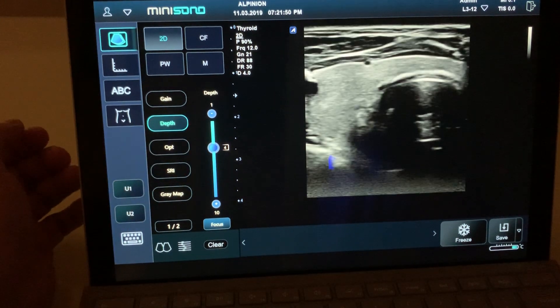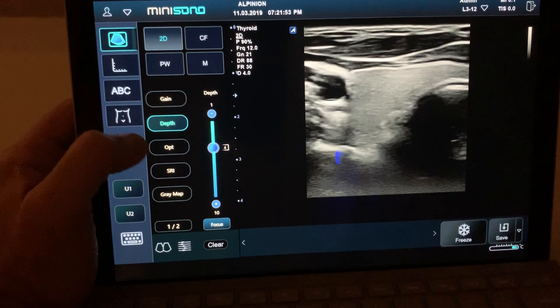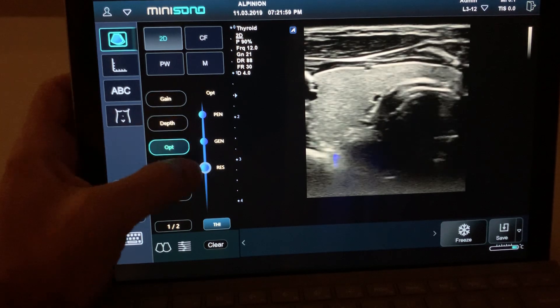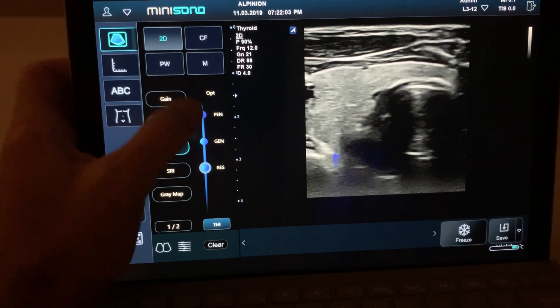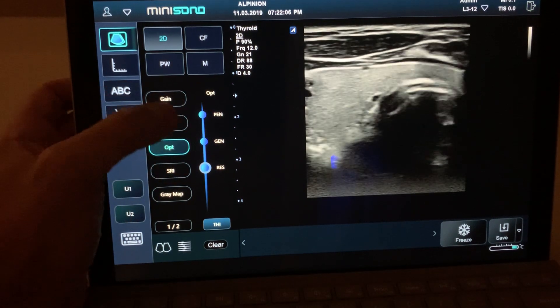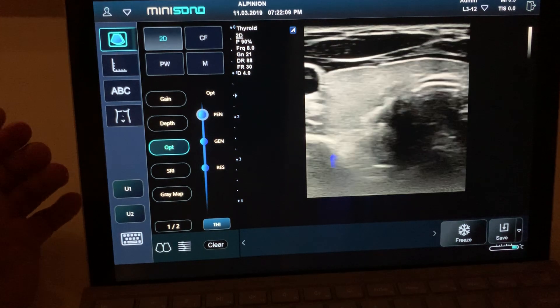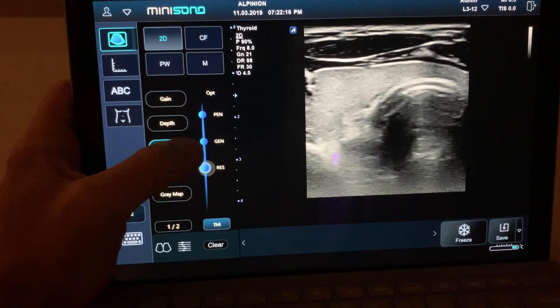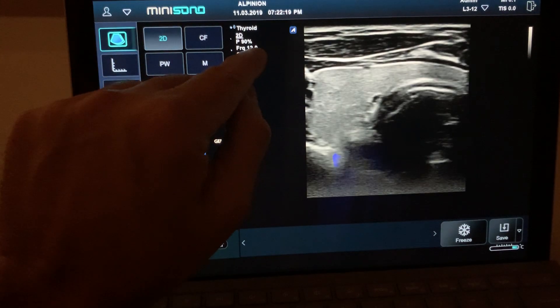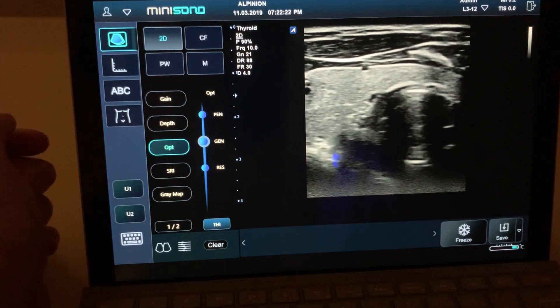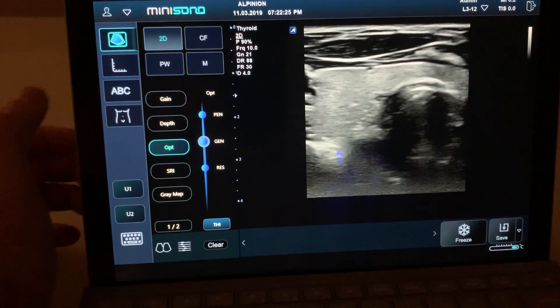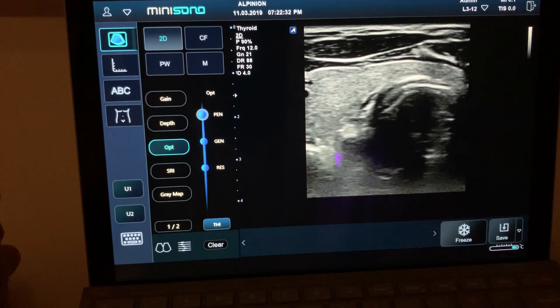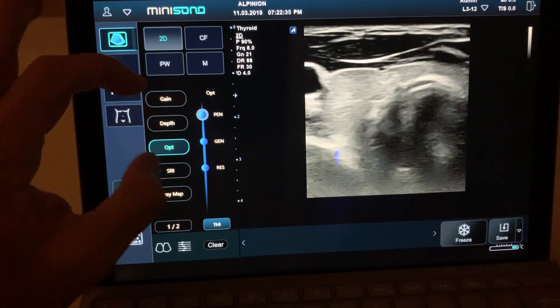If you need to change the frequency, go to the 'OPT' option. You can see: RES for resolution, GEN for general, and PEN for penetration. If you need more penetration, click 'PEN' — the machine changes the frequency, in this case going to 8 MHz. When you go to resolution the machine does 12 MHz; general is 10 MHz. When you have a patient you need to go deeper, remember to use the OPT key and select penetration.